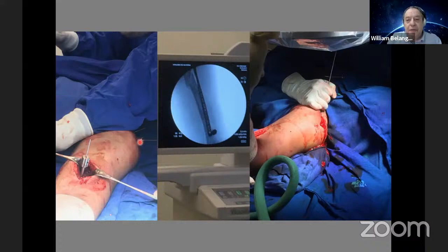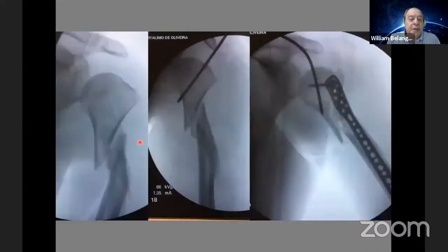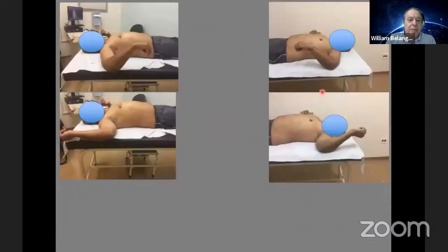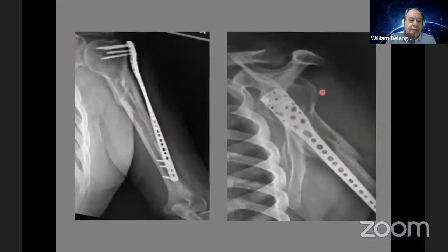Now we start to fix. The first thing that we need to do is to reduce the proximal fragment. Then we use a Steinmann pin like Dr. Shiva, and we reduce the proximal fragment, and we then start fixation of the plate in the proximal part using 1 or 2 screws. Then we go down to fix the distal part. This is the patient after bone healing, and this is the fracture healed.